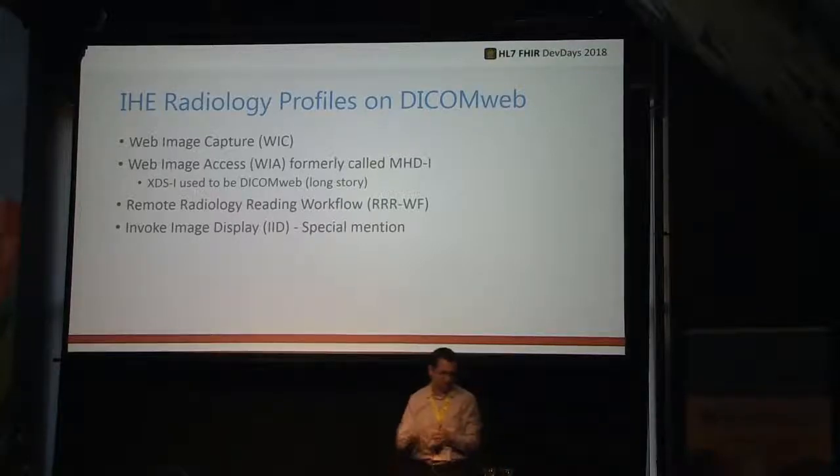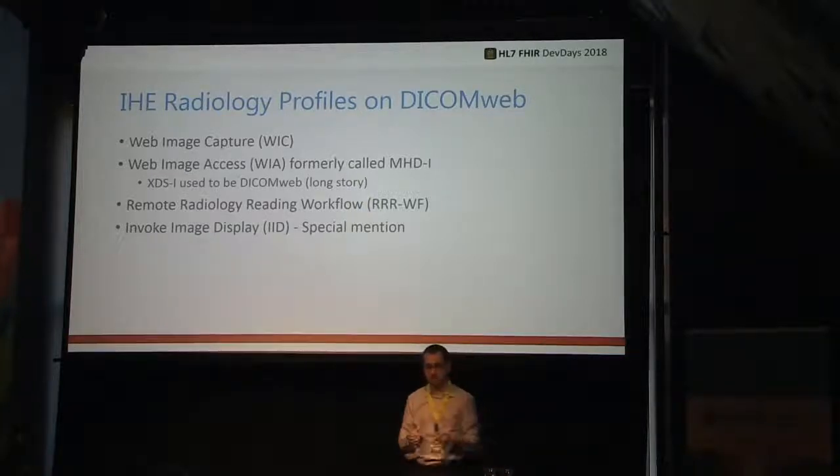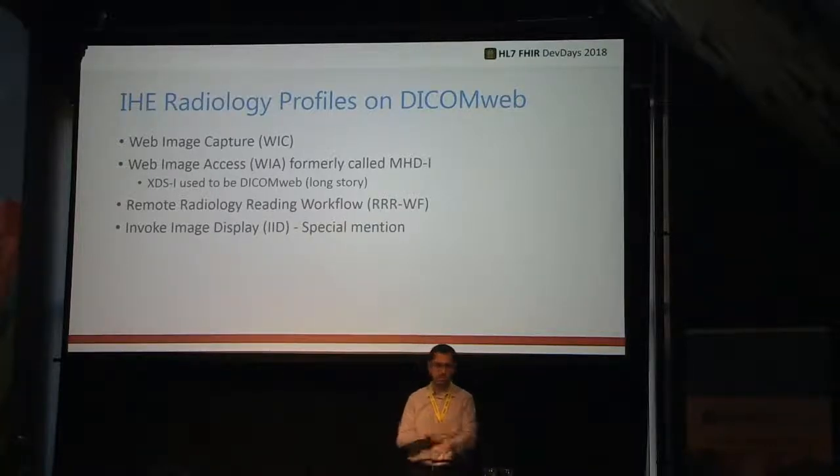Okay, a couple of things to keep in mind. Brad always likes to put some updates on new standards. There's a new one called Web Image Capture. It's a standard for being able to capture images through web interfaces. It's pretty useful because, believe it or not, nowadays in a lot of hospitals, they actually do use phones or iPads to take pictures of patients, like an open wound or stitches or rash. We don't really have a good standardized way right now until this standard comes out to do that. Vendors have different implementations, but nothing very specific.